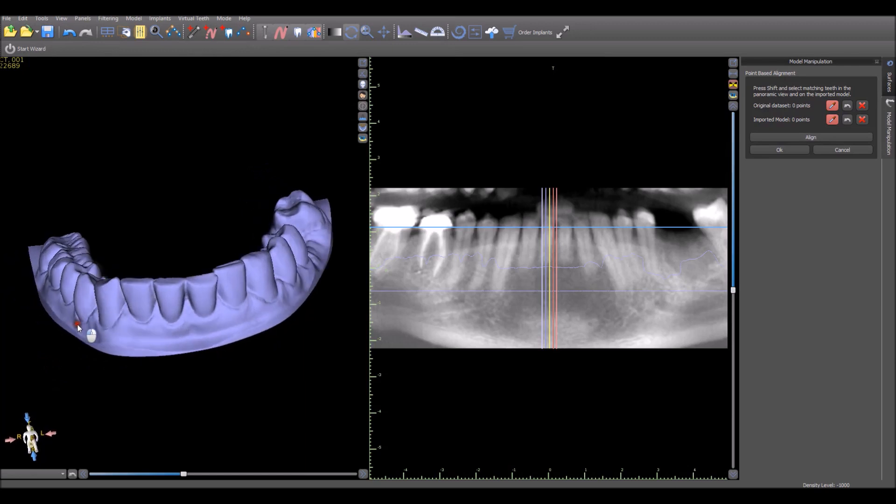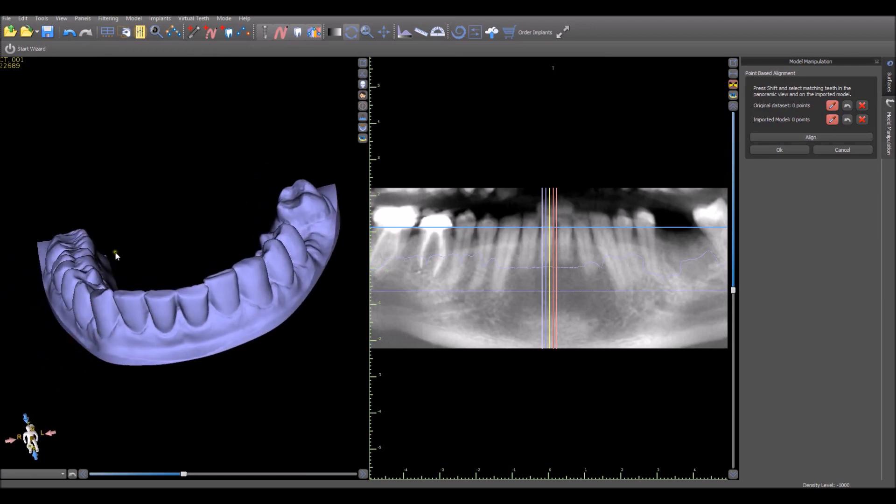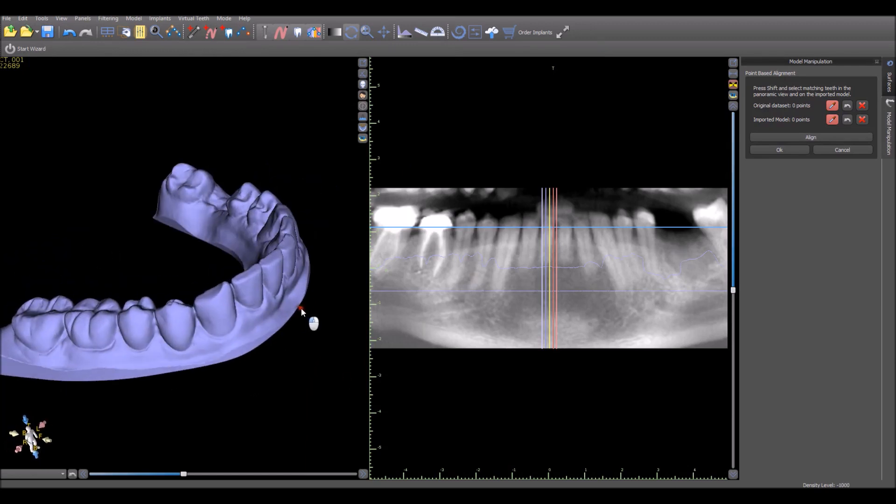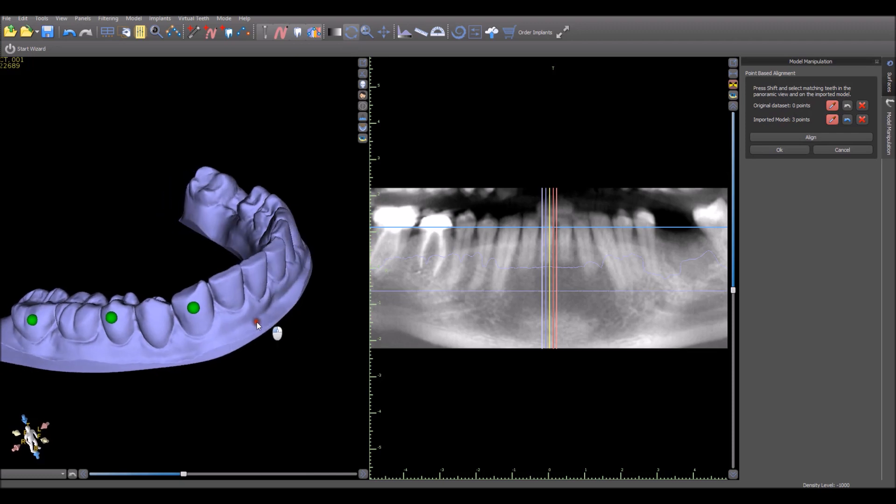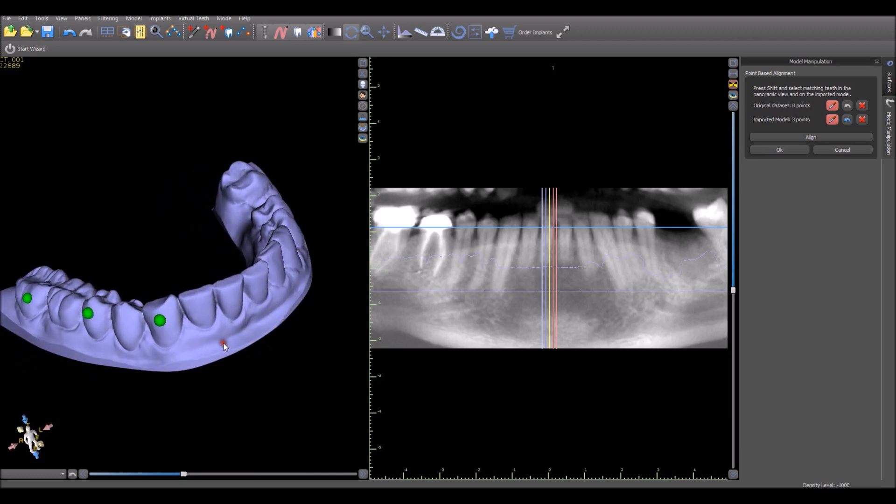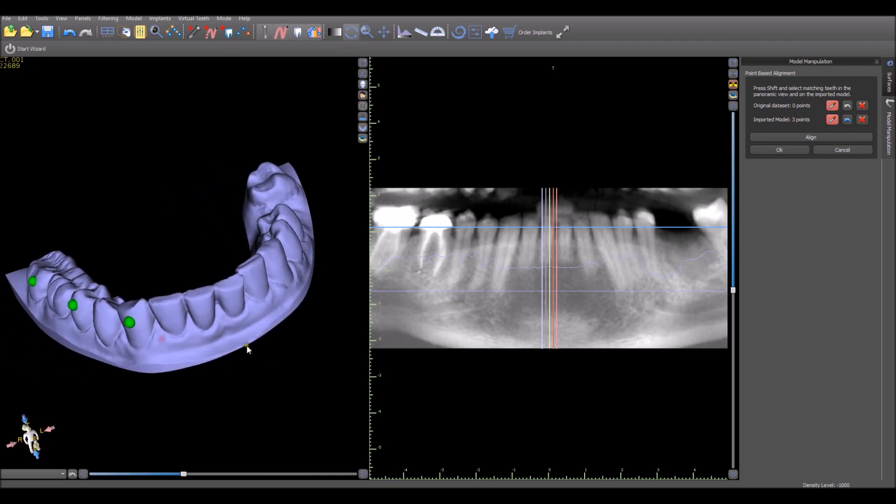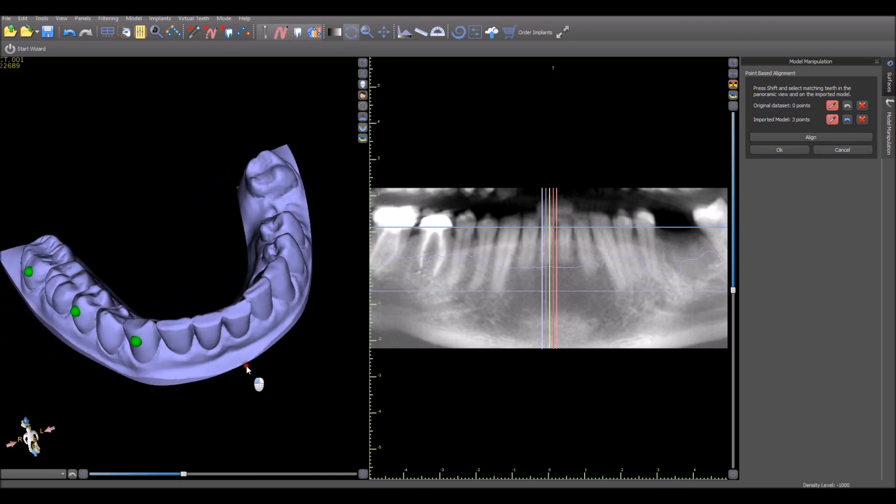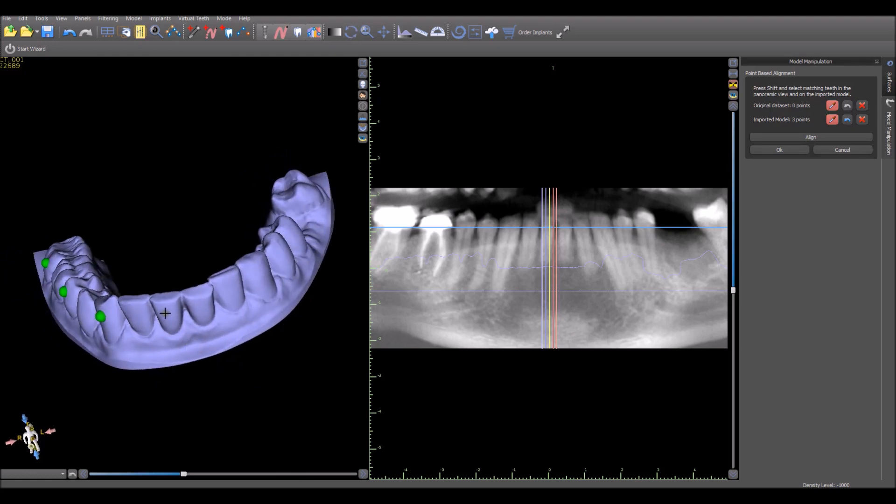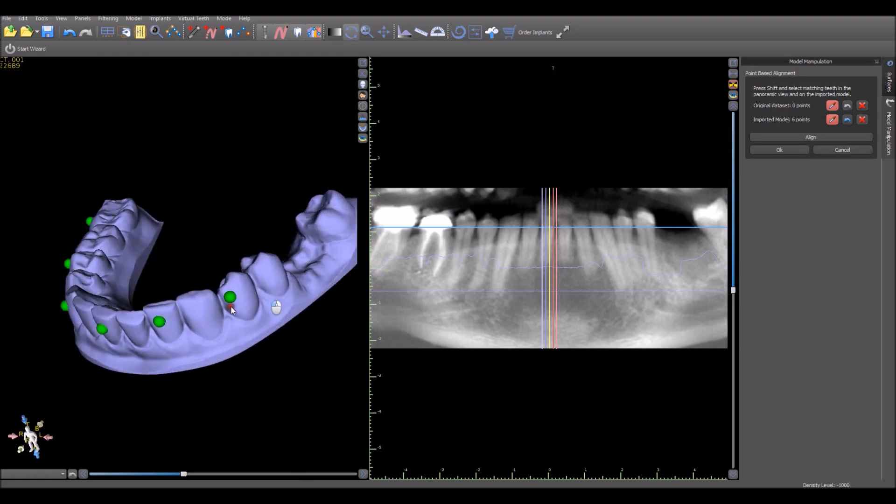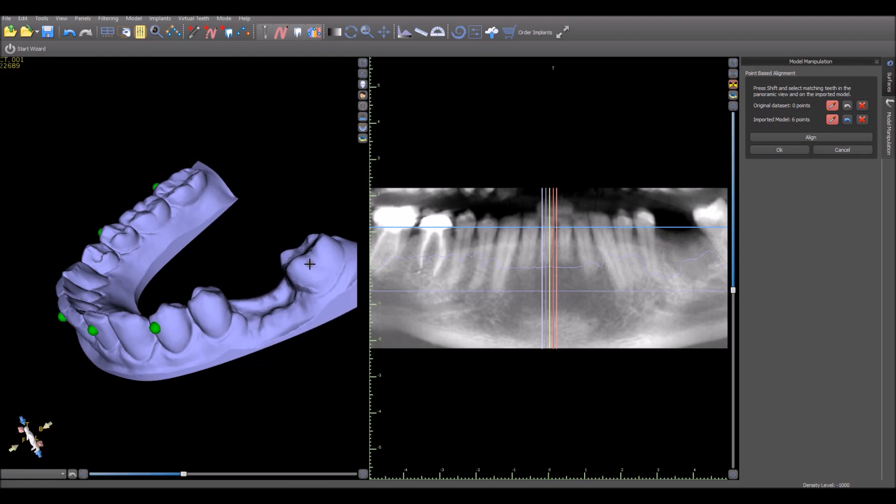Here you have the model showing up on the left side of the screen and the CT scan on the right side of the screen. What you want to do is hold down your Shift key to mark points. I usually mark every other tooth with a point. Just place the point in the center of the tooth. When you want to rotate, just let go of the Shift key. Use your left mouse button to rotate the model.